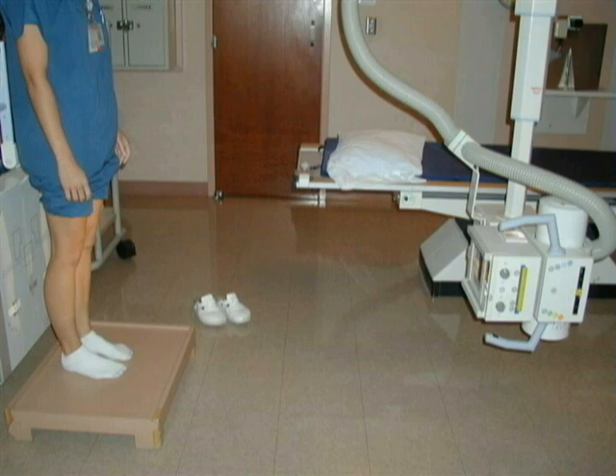The AP standing projection of the knees is performed with the patient standing upright, with toes straight ahead, and weight equally distributed in front of a 14 by 17 inch lengthwise image receptor.